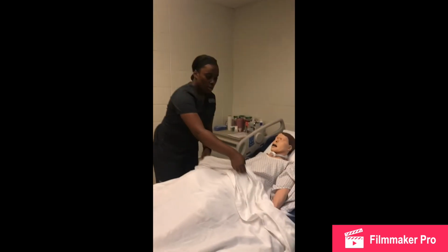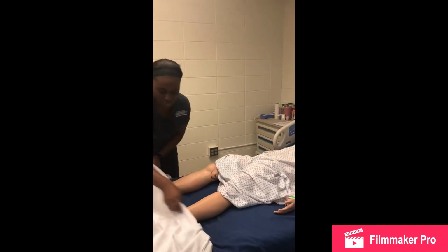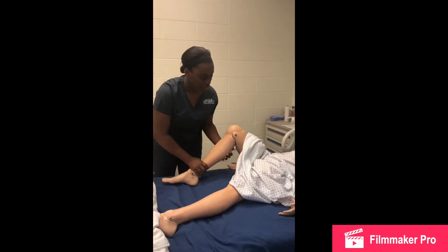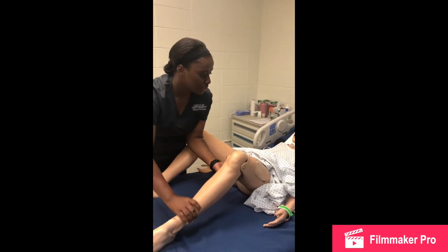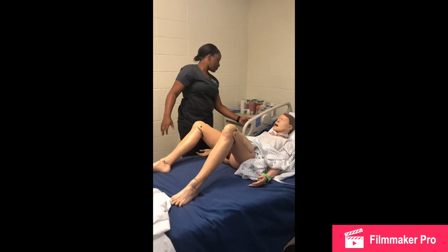Provide privacy for my patient. I will pull back his blanket, or in this case, we're performing on a female, so it'll be her. Set in the proper position, and I'll make sure my bed is at proper height.